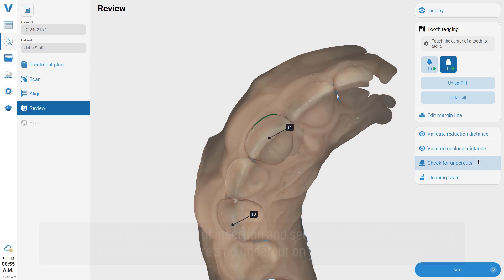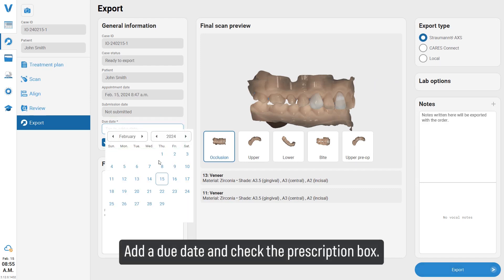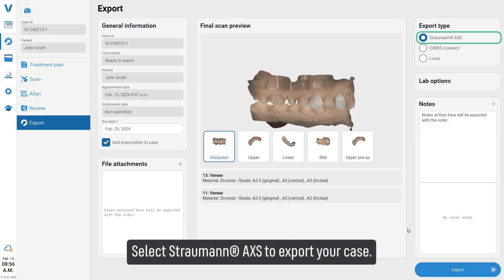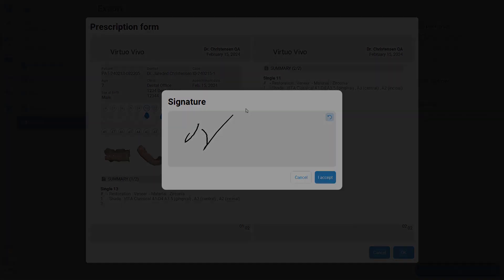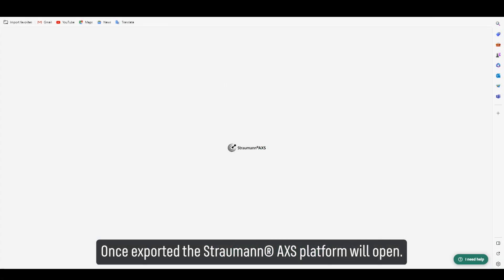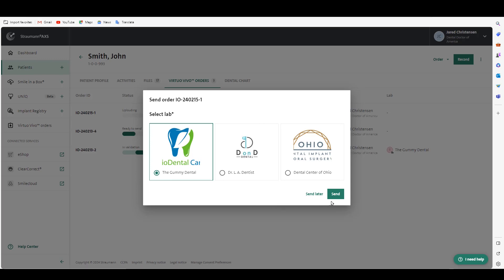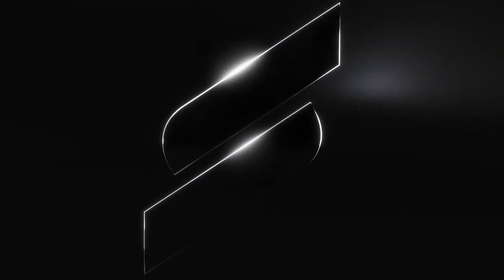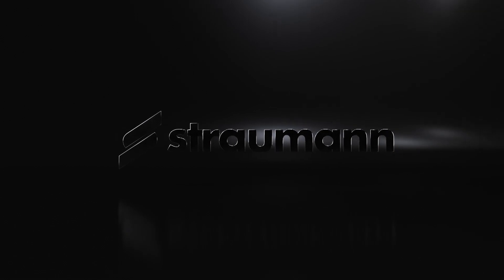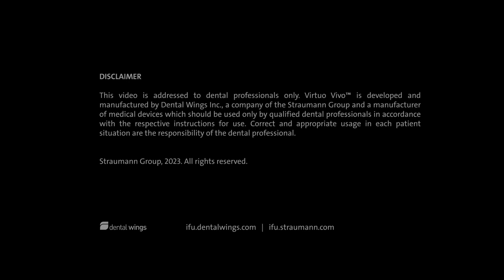Place the scan file in the axis of insertion and select the check for undercuts tool to confirm there is no undercut on your preparation area. Select next to move to the export screen. Add a due date and check the prescription box. Select Straumann Access to export your case, hit export, and sign the prescription. Once exported, the Access platform will open — select your desired laboratory and hit send.